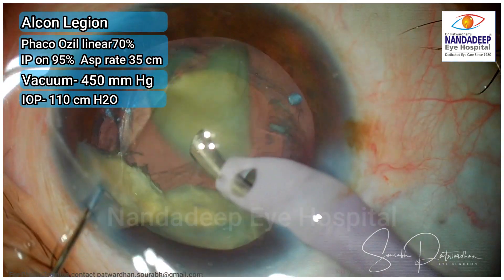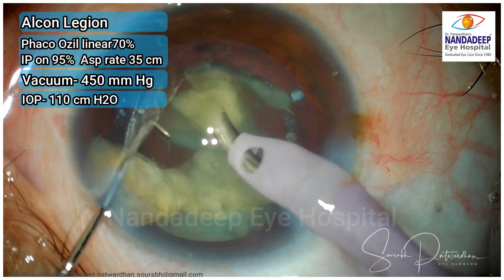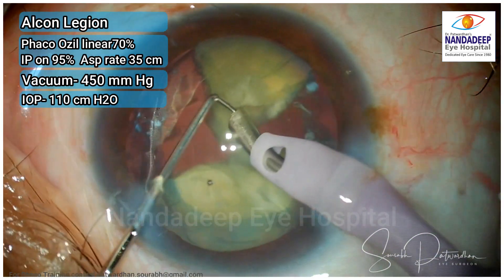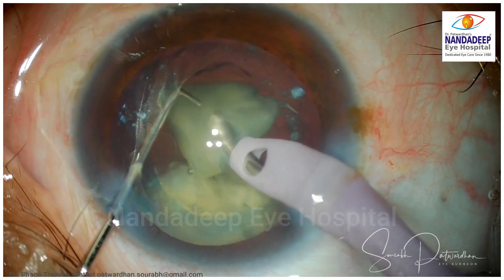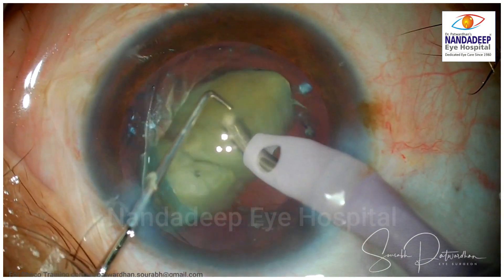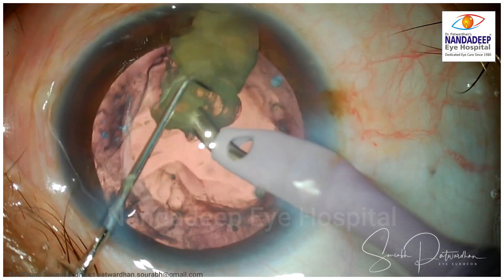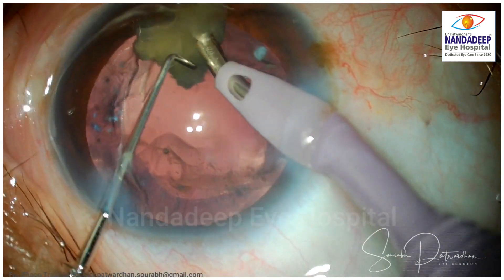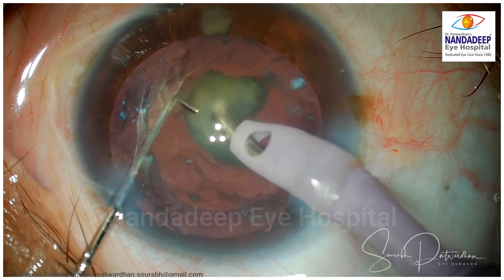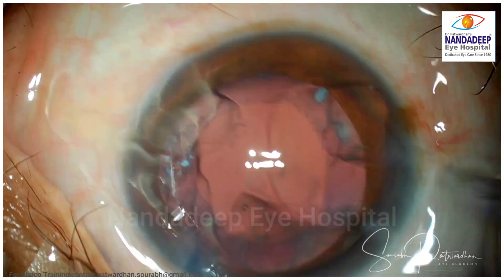Now I move on to the quadrant removal mode where I am going to use Ozil, which is torsional phaco, with 70% power. I am using the balance tip of Alcon and 450 vacuum. I am using the Alcon Legion machine here, which is a gravity-based infusion system and gives very good anterior chamber stability with 110 cm of bottle height. It is very essential for doing phaco that you have a very stable anterior chamber. Ozil is an excellent tool for emulsification — it produces minimal heat around the incision, no chances of wound burn, and the emulsification produced is fantastic without any chattering of the nuclei.